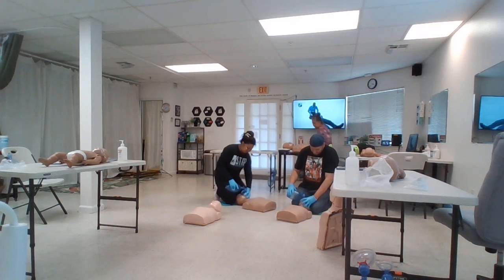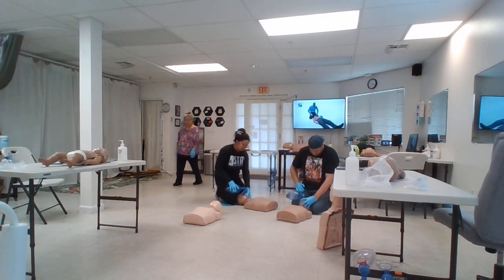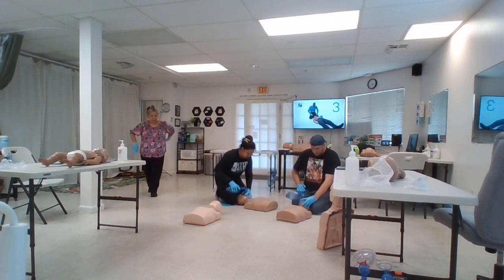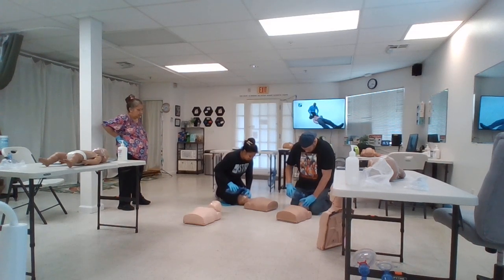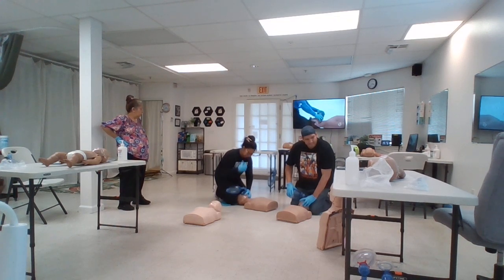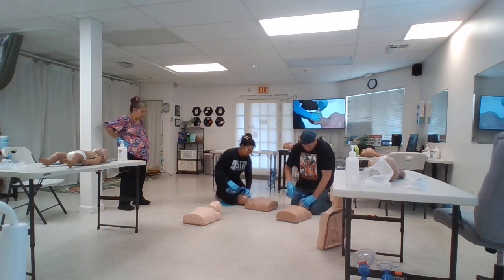Now that we're ready, let's practice using the bag mask device. Follow along with the video. Here we go in 3, 2, 1. Give 2 breaths. Watch for chest rise.